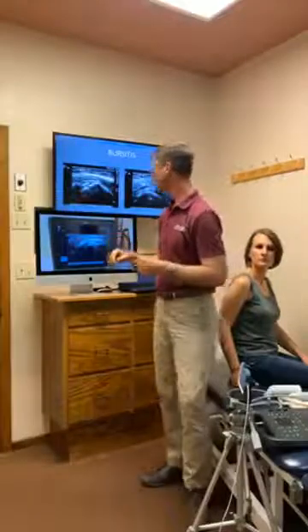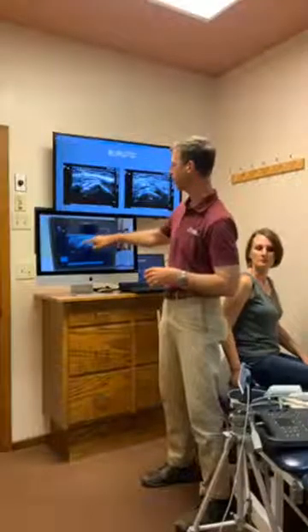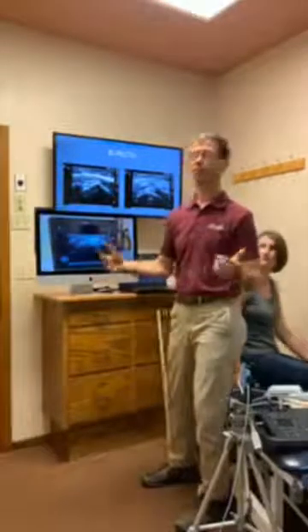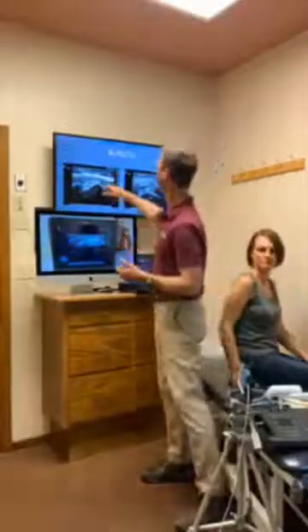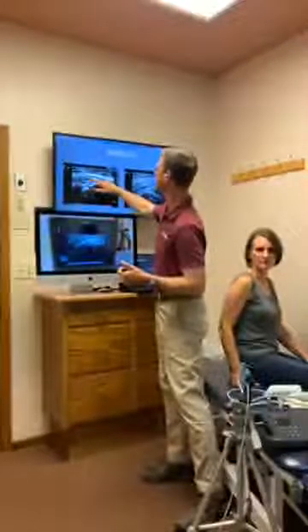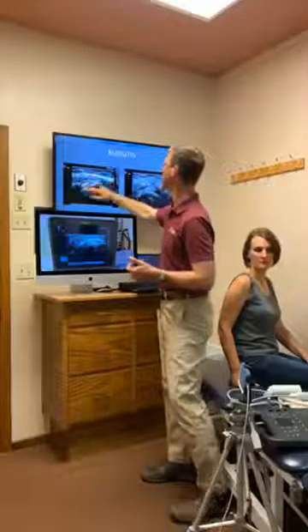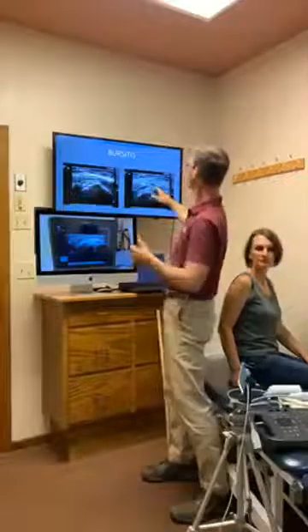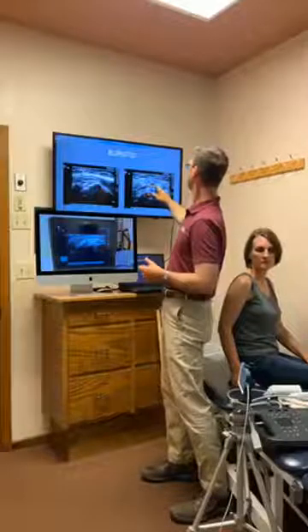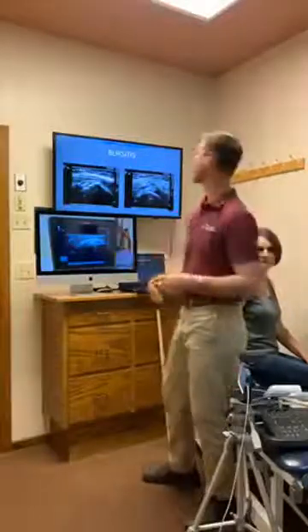And so a normal bursa, the bursa actually is lying right over there between the tendon, okay? You don't see it because it's normal. However, with pathology or problems, here's the bursa. You can begin to see it because it's now filled. So you get this hypoechoic area, all right, and then flipping over onto the short axis view, you can see the same part of the bursa right there, all right? So we now have a bursitis issue.